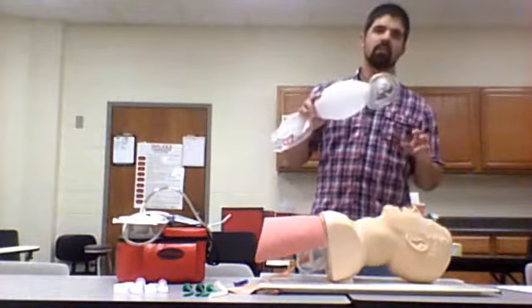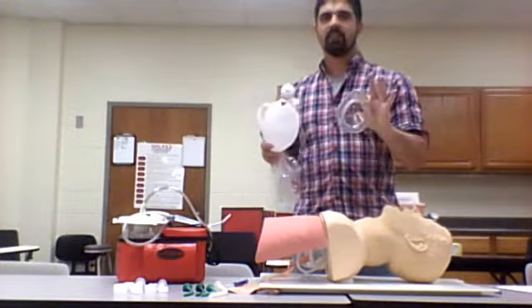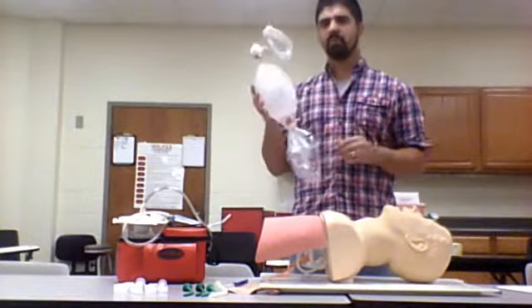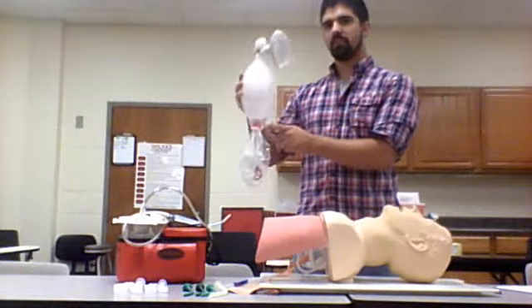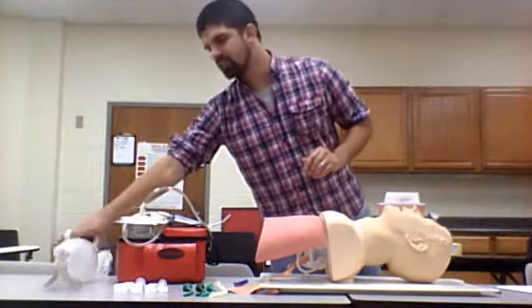And lastly, our BVM, our bag valve mask. This actually has a mask seal. It detaches, hooks up to the BVM. Anytime we're using a BVM, we want to hook up to at least 15 liters per minute high flow. The O2 line will hook up here, and we can provide positive pressure ventilation that way.